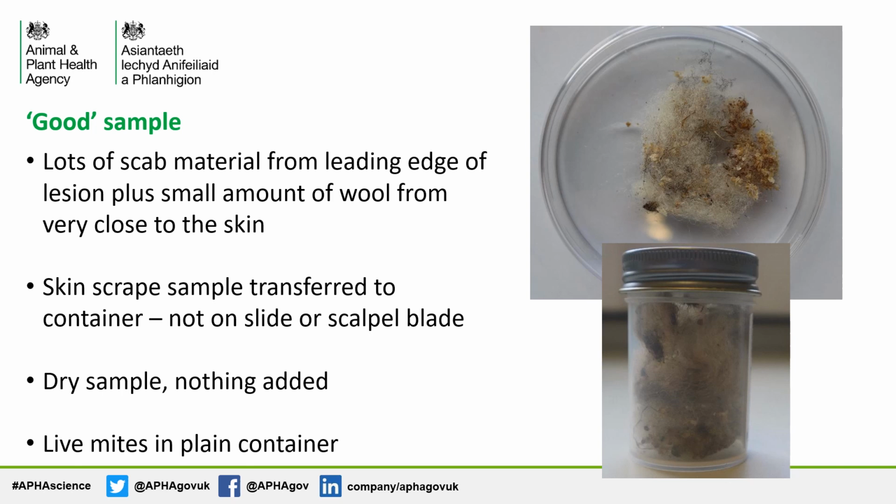The skin scrape sample should be transferred to a container and not submitted on a slide or a scalpel blade. The sample should be dry with nothing added. Live mites can be submitted in a plain container.